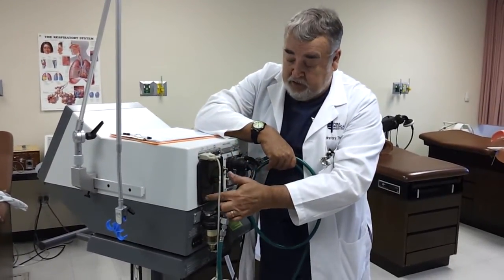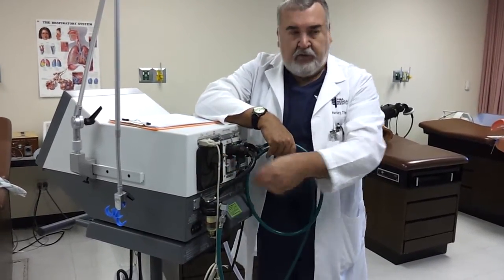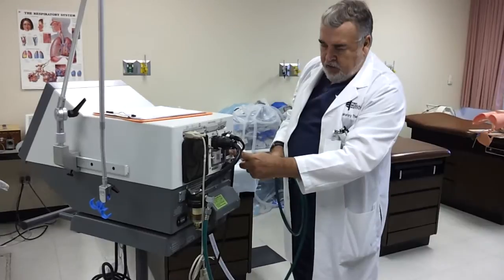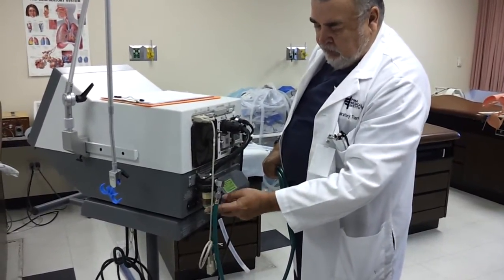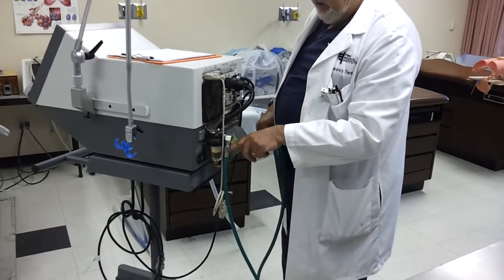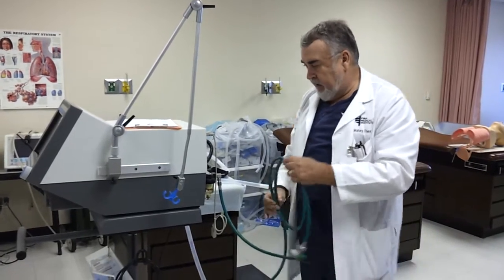Remember to clean this off real good when setting it up between patients. This snaps right off, and you just take the filter, wet it, blot dry it, and put it back on again. Here are your circuit breakers. This is your electrical connection. This little trap here gets any water condensation that comes in from the tubing and collects it so it doesn't go inside the vent and short circuit things. So those are your basic connections.